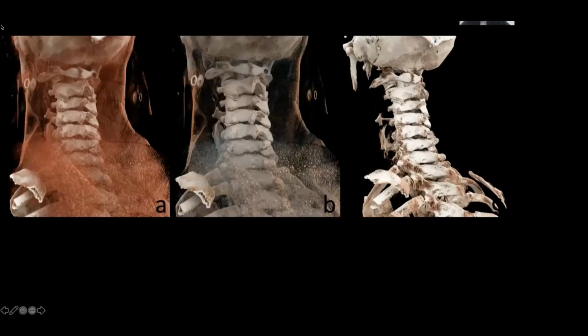I just throw that out there because what you'll probably see either now or over the next few years, a lot of vendors purporting to have technology that allows you to visualize structures directly over the skin, and in the majority of cases, that's actually not the case. There's actually a significant margin of error. The best algorithms that we've seen have been probably a minimum of 8 millimeters of error if you try to overlay digital information on soft tissue.